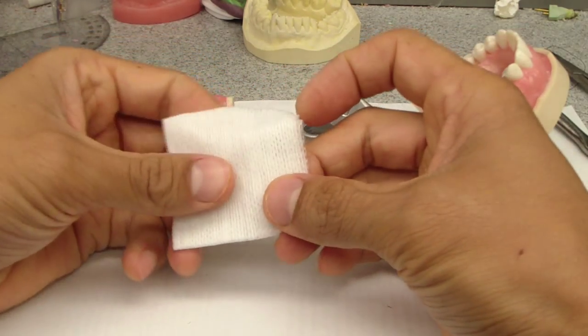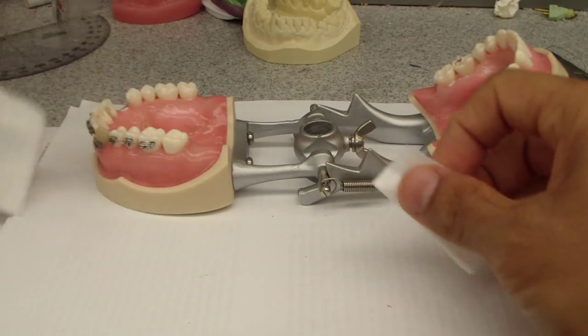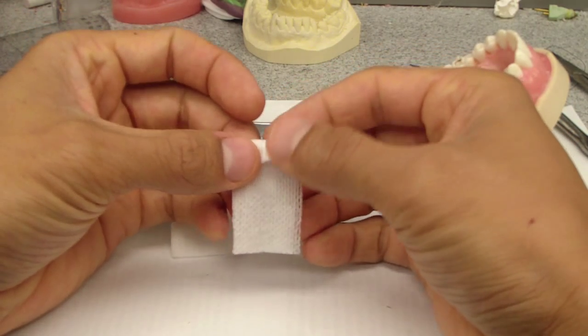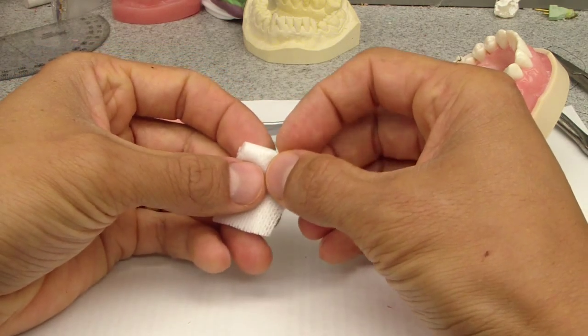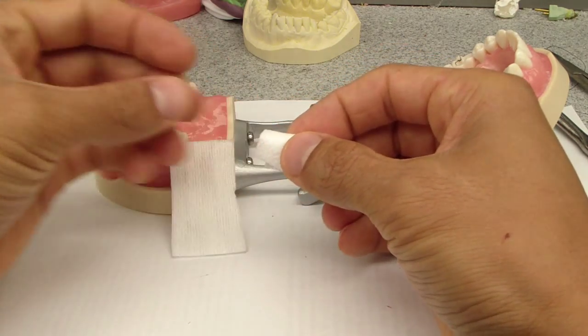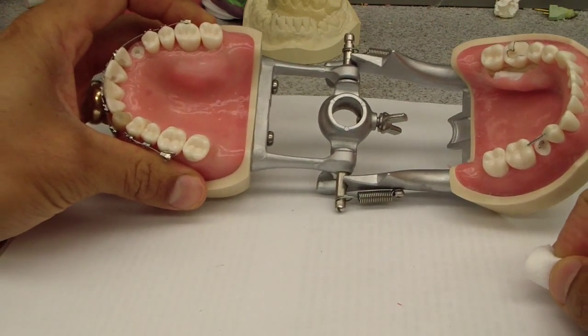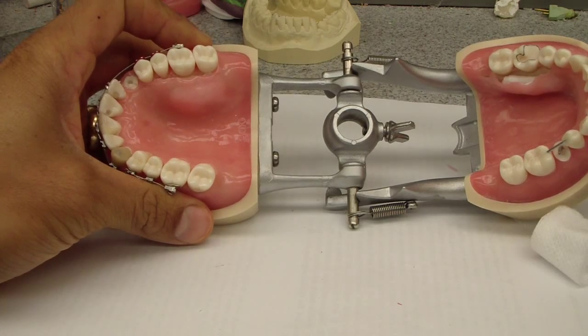It just takes a simple 2x2 — cut it. Every situation is going to be different, just cut it and fold it up. The key thing is to remember to remove it and not leave it in situ. Just pack it underneath your flap and it remains there for as long as you need it.